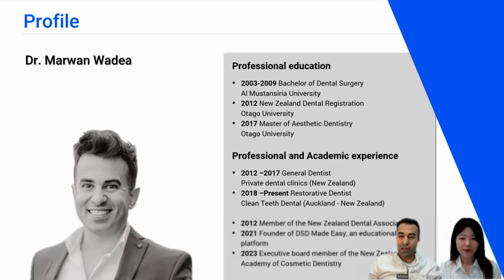With the simple UIs that Medit has to offer, it was easier to absorb and learn. And when I do a project, the project will grow. I'll take it to Medit Design, then I'll export the design to a model builder in order to make a printable 3D object. And I do have a 3D printer in-house where I technically design and print my own cases.